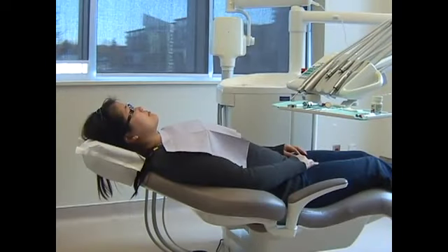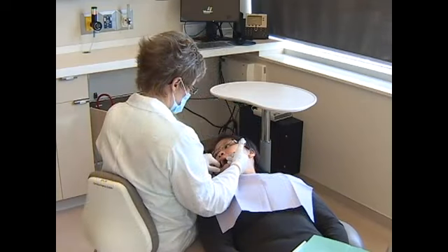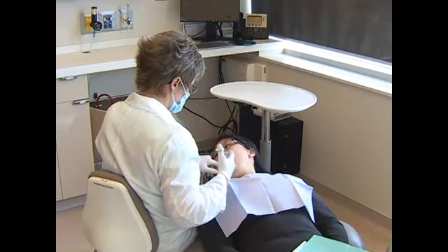The client is semi-supine with the mandibular incisors perpendicular to the floor. The right-handed operator sits between 9 and 10 o'clock for the left inferior alveolar injection and between 8 and 9 o'clock for the right inferior alveolar injection. The intraoral landmarks for this injection are the pterygomandibular raphe, the coronoid notch, and the maxillary and mandibular occlusal planes.